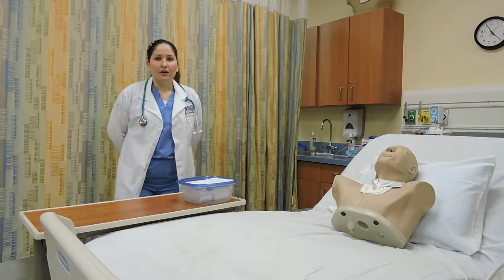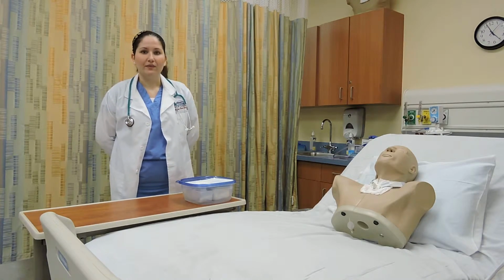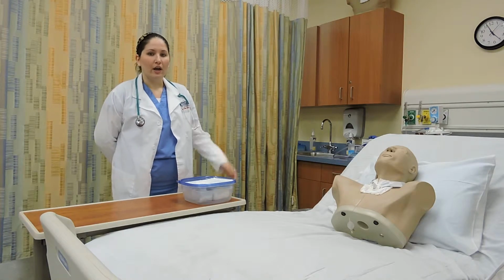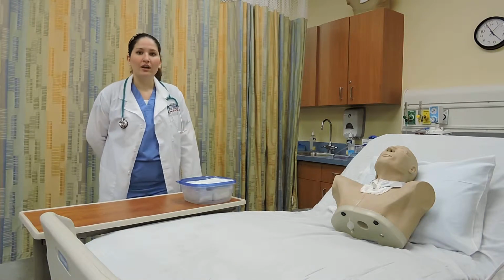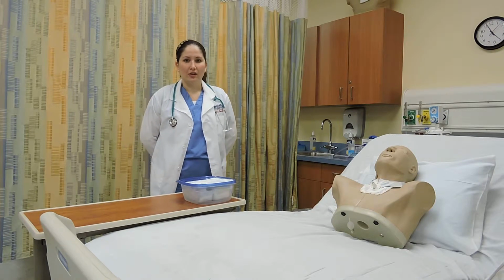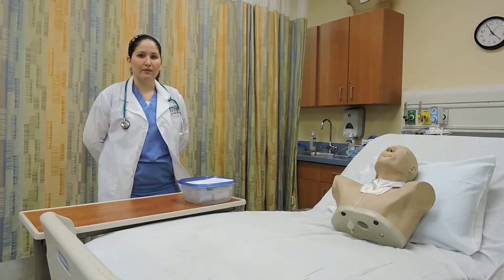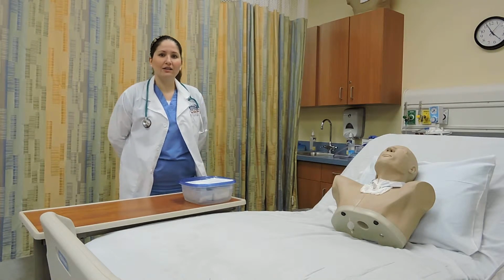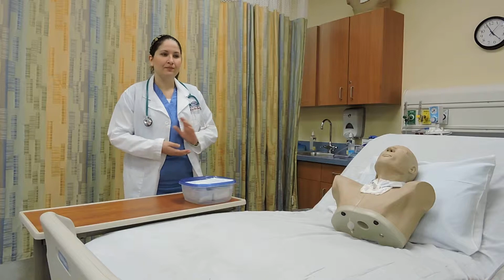As with any other procedure, we're first going to verify the physician's order to make sure that the patient needs trach care. Then we're going to knock on the door, come into the room, introduce ourselves to the patient as an RT student, and explain the nature of our visit. Then we're going to perform hand hygiene for at least 15 seconds and don the non-sterile gloves.